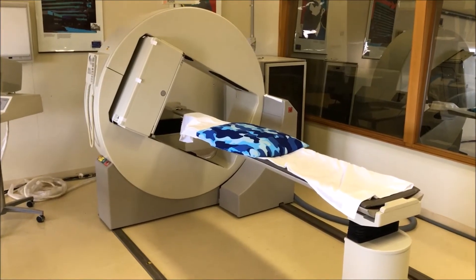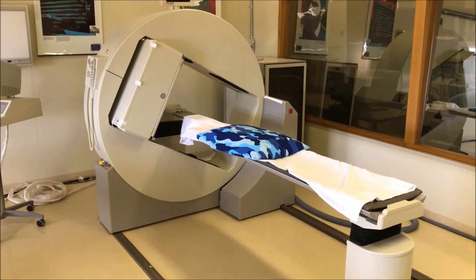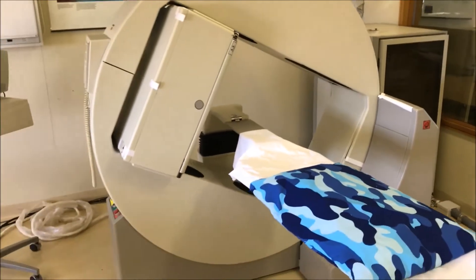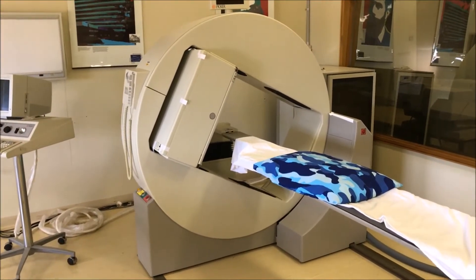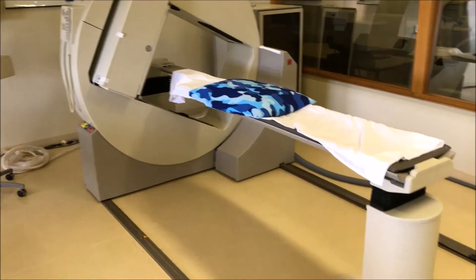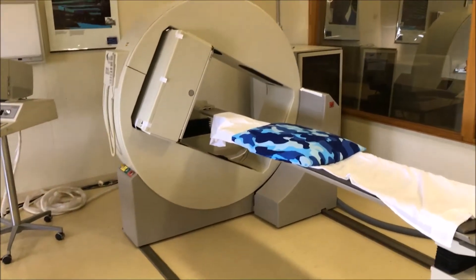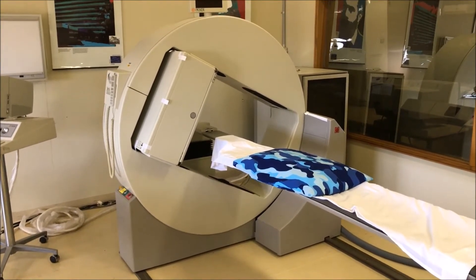The next generation of gamma cameras, typified by this Picker system — which was quite common across the globe — all of a sudden gave us gantry security. This is a single-head system sitting in a bigger gantry, and that gantry gives it a lot more stability than the old GE-style systems where the very heavy detector head sat out on the end of an arm. This system is also characteristic of a small floor plan — very efficient. The bed stays in the same position while the gamma camera rolls down across the bed to produce a whole-body scan, taking up a very small footprint.